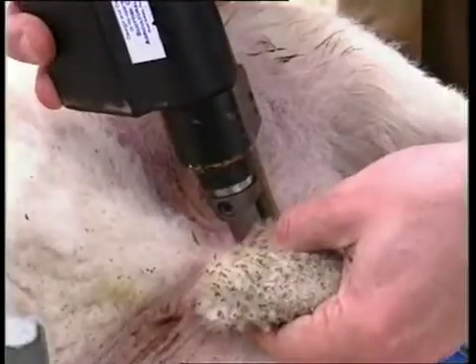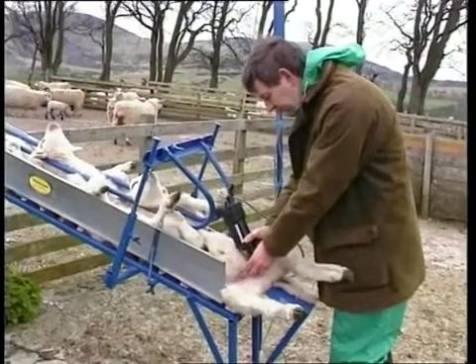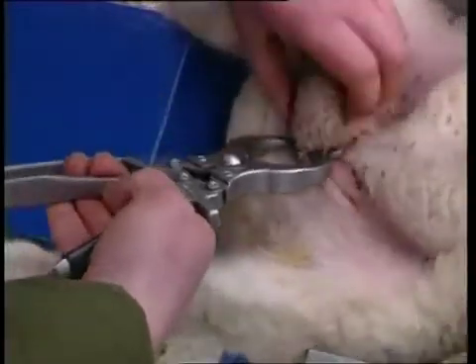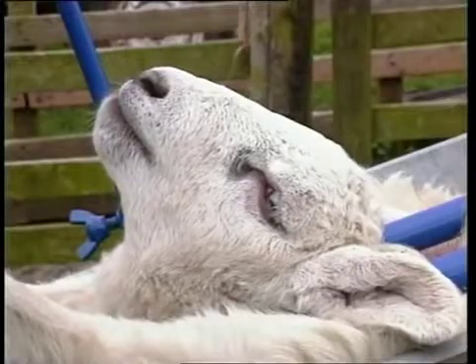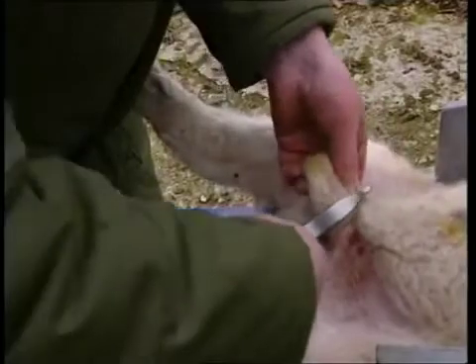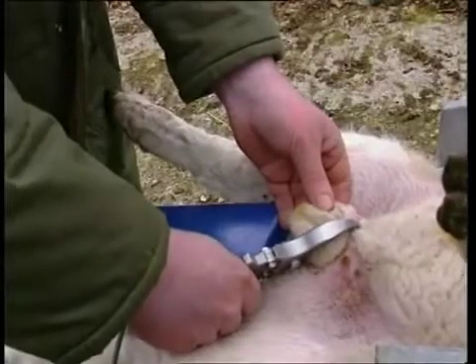Trials with a prototype powered version have shown a five-second application time to be just as effective as 10 seconds, without causing any more distress to the lamb. To use the Ritchie Nipper, locate the nearest cord in the scrotal sac and slide it to the side of the scrotum. Once the cord is located in the jaws, close the handles together until they lock. Leave them for the set time, then release. Once one cord is emasculated, slide the jaws across to the other side and repeat the operation on the other cord. Take care not to catch a teat, as this will result in a larger wound than necessary. You may repeat the operation on each cord if you wish in order to be absolutely sure.